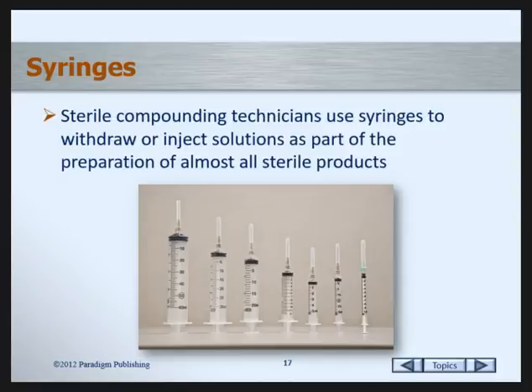Next, we're going to talk about syringes. Before you began this course, you did an orientation that dealt with syringes. I know that you've covered syringes and pharmacy math, but we're going to review again. This is going to be about the specific components and identifying critical sites associated with a syringe, not about the gradients and measurements.